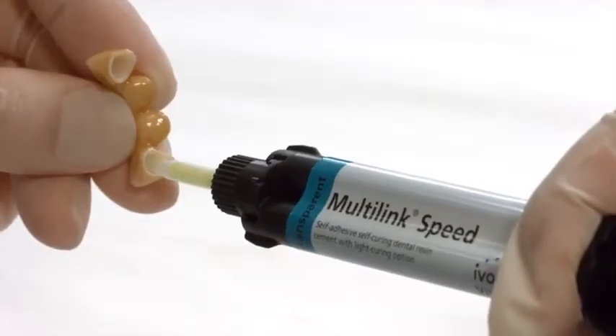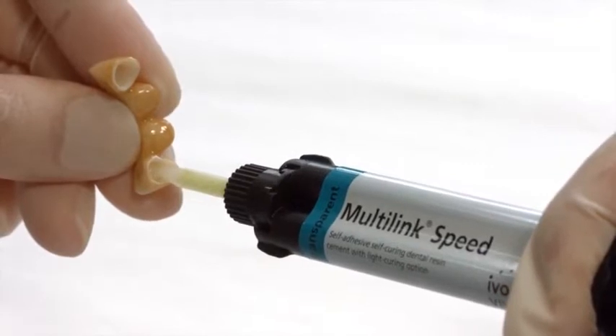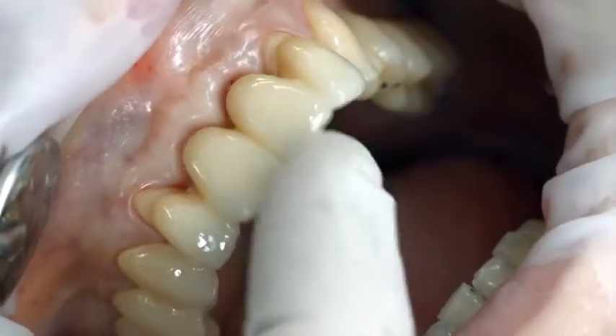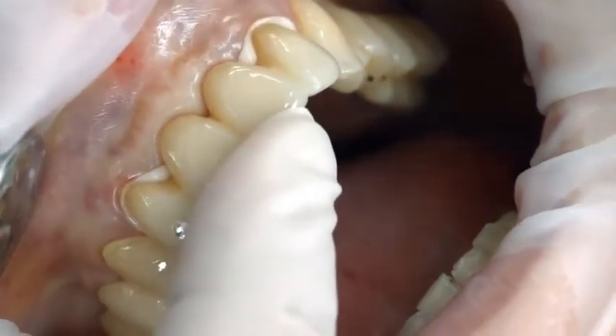Apply the desired amount of Multi-link Speed directly from the auto-mix syringe to the bonding surface of the restoration. Seat the restoration and hold it in place, exerting uniform pressure.